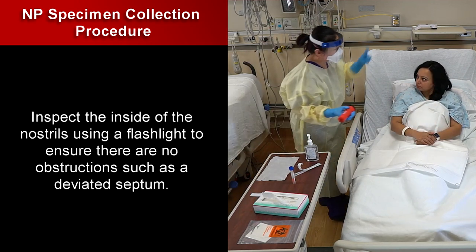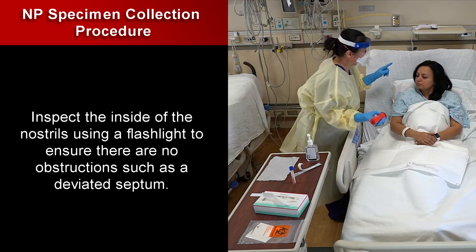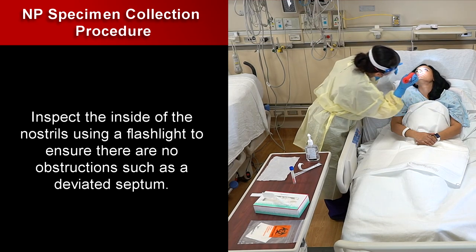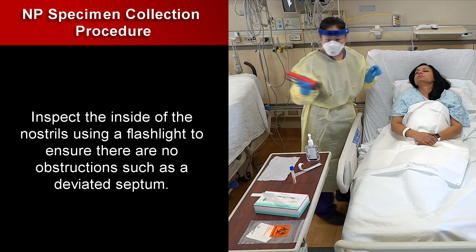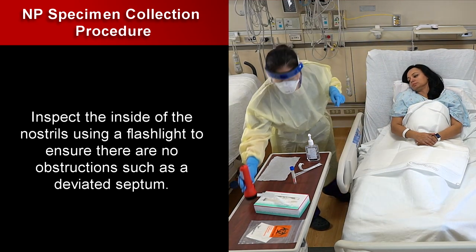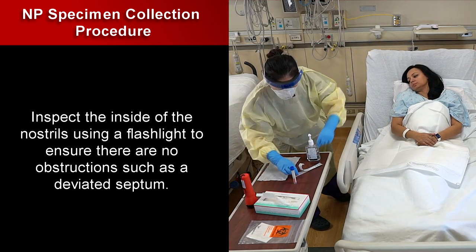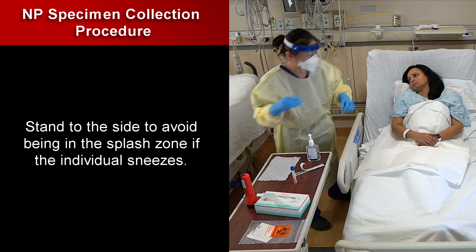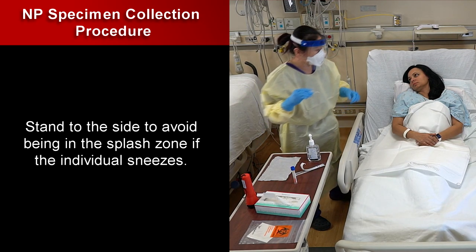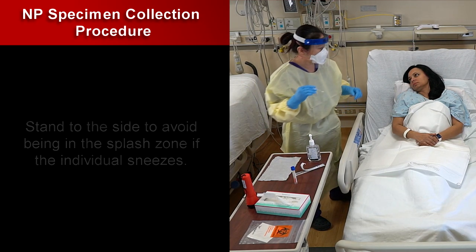Inspect the inside of the nostrils using a flashlight to ensure there are no obstructions such as a deviated septum. Stand to the side to avoid being in the splash zone if the individual sneezes.